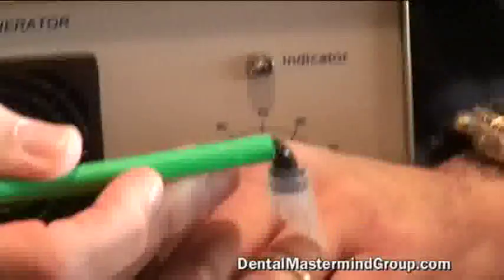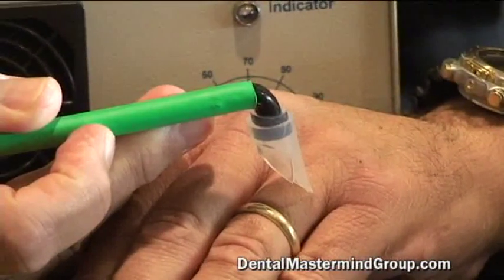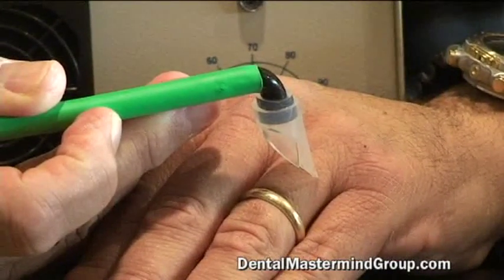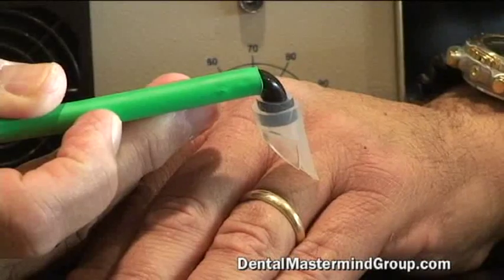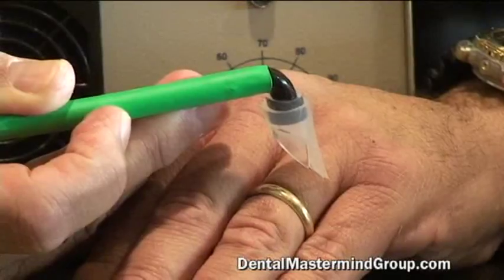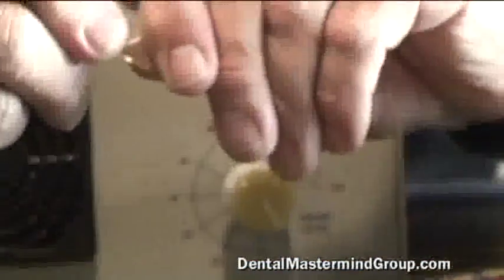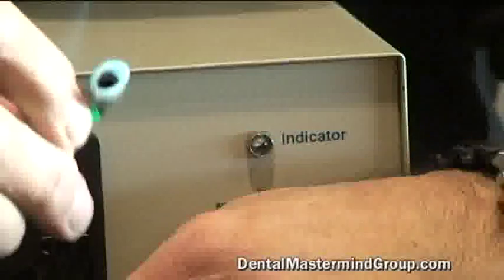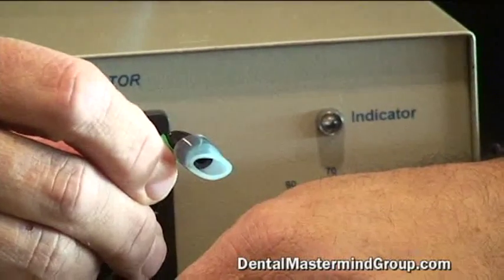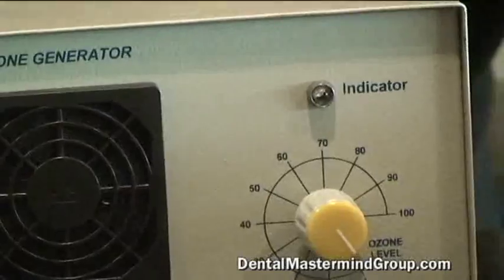Here's the handpiece that would be connected directly to the gas generator. There are some foot controllers that make it a little bit easier, but you don't have to get very fancy. This also has a thinner cup for smaller teeth. Simple as that.